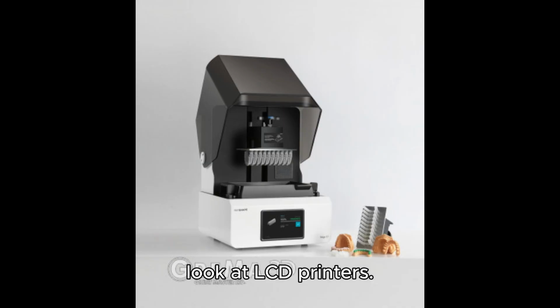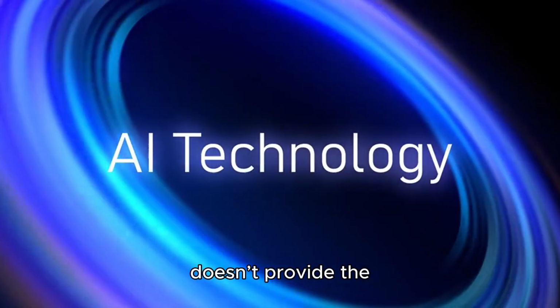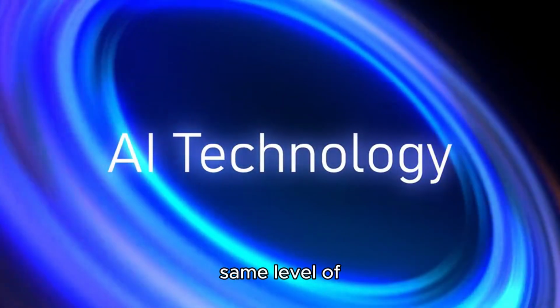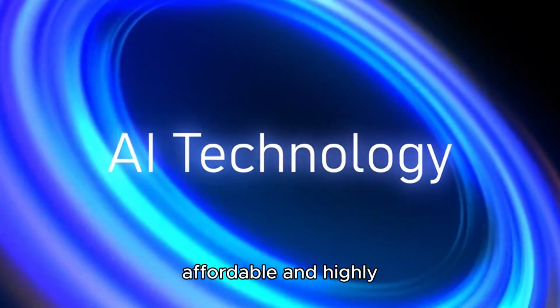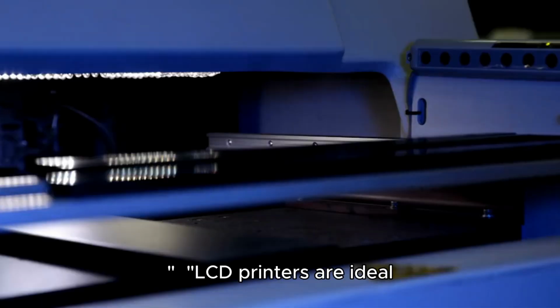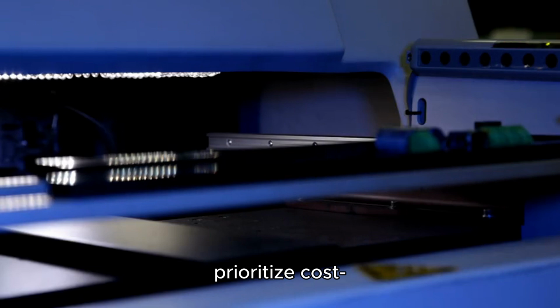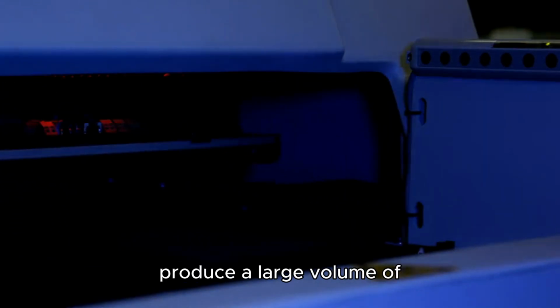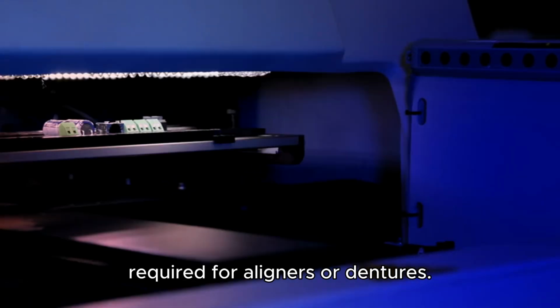Finally, let's look at LCD printers. LCD printers cure resin using an LCD screen as a light source. While this technology doesn't provide the same level of resolution as SLA or DLP, it's much more affordable and highly efficient for larger batch production. LCD printers are ideal for practices that prioritize cost-effectiveness and need to produce a large volume of models, such as those required for aligners or dentures.